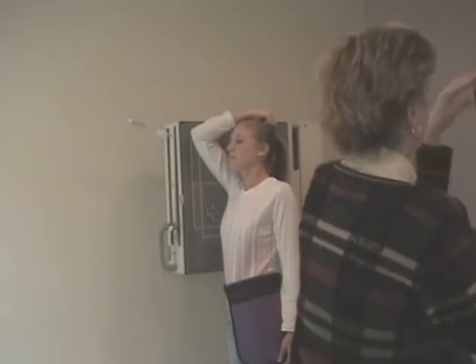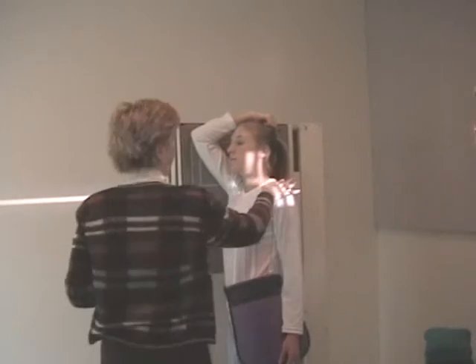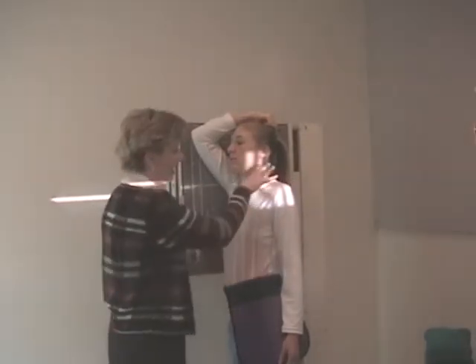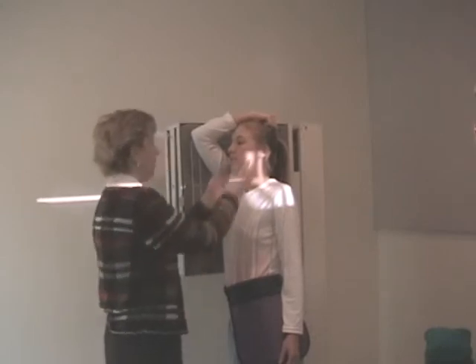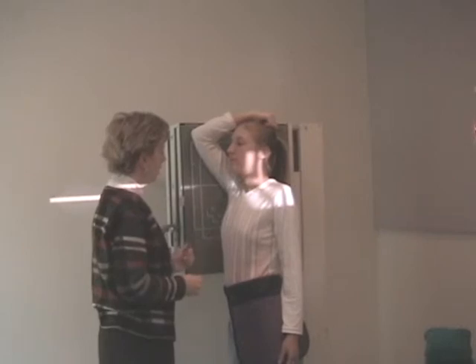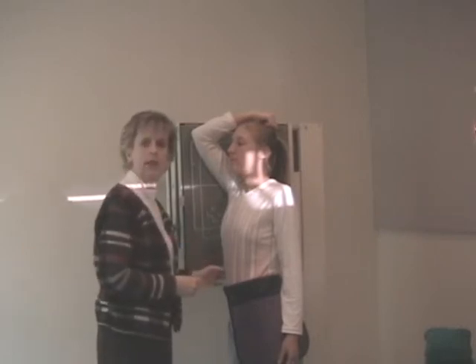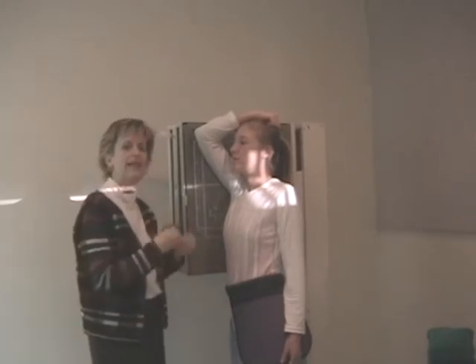But see now how we're clearing that cervical vertebra? Again, her shoulder stayed up. I'm trying to mock something. If you can't clear the shoulder, put a caudal tube angle on there. Okay. Head again, stay straight and no rotation. And I think the camera got a pretty good look at the twining position here. Again, this is not routine. It's only if needed to demonstrate C6 or 7 or T1 or T2.